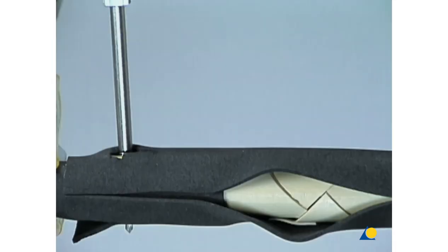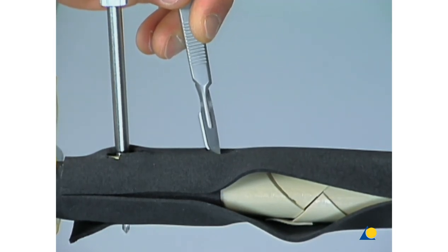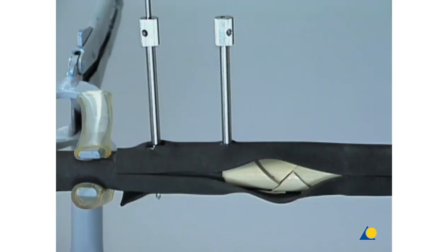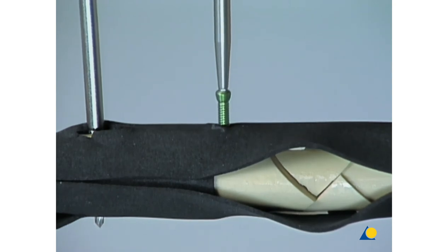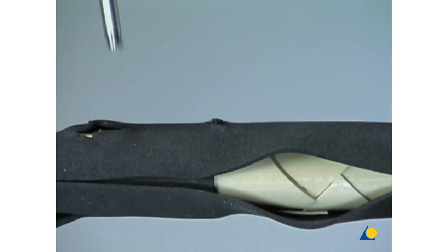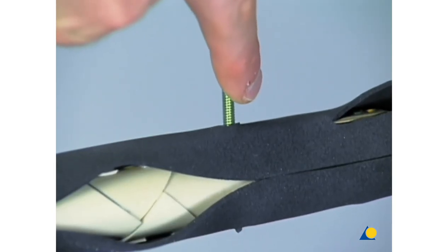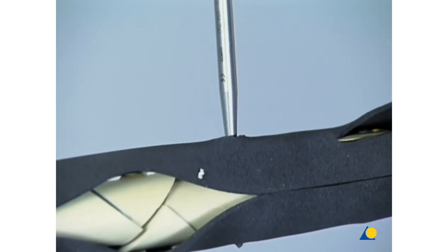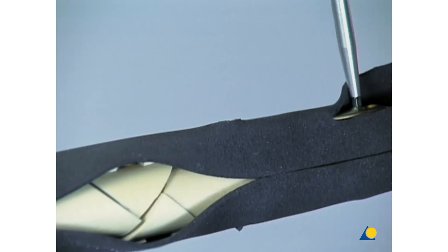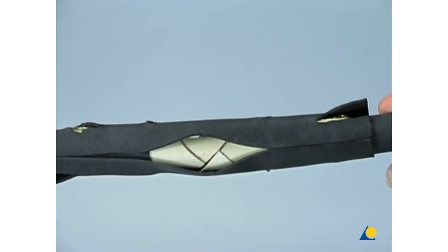Another plate hole is found by palpating the plate surface. If necessary, the image intensifier can be used to locate the holes. After incising the skin, the second drill sleeve is carefully inserted and the second 4.3 millimeter drill bit is used. The corresponding self-tapping locking head screw is inserted. Only now are the drill bit and drill sleeve removed from the end hole and another locking head screw inserted. Additional locking head screws must be inserted, avoiding the comminuted fracture zone. At least two screws per main fragment are required. As bridge plating with an LCP provides relative stability only and protects the bone vascularity for its entire length, bone healing by callus formation will be enhanced.